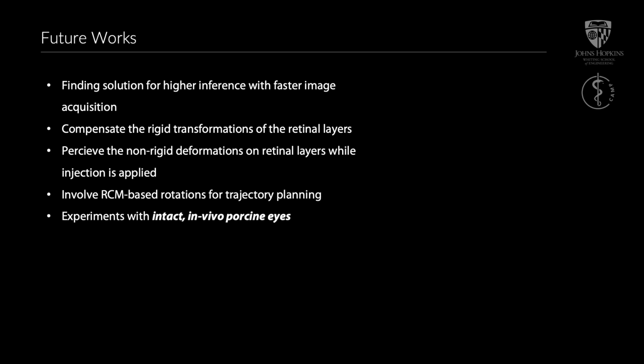As potential next steps, we aim to develop a solution for faster acquisition of OCT volumes to enable closer to real-time processing. Additionally, we recognize the need for non-rigid registration of volumes when acquiring real-time volumes. Furthermore, we need to incorporate not only translational transformations, but also RCM movements. Lastly, we plan to conduct further experiments on intact and in vivo porcine eyes.